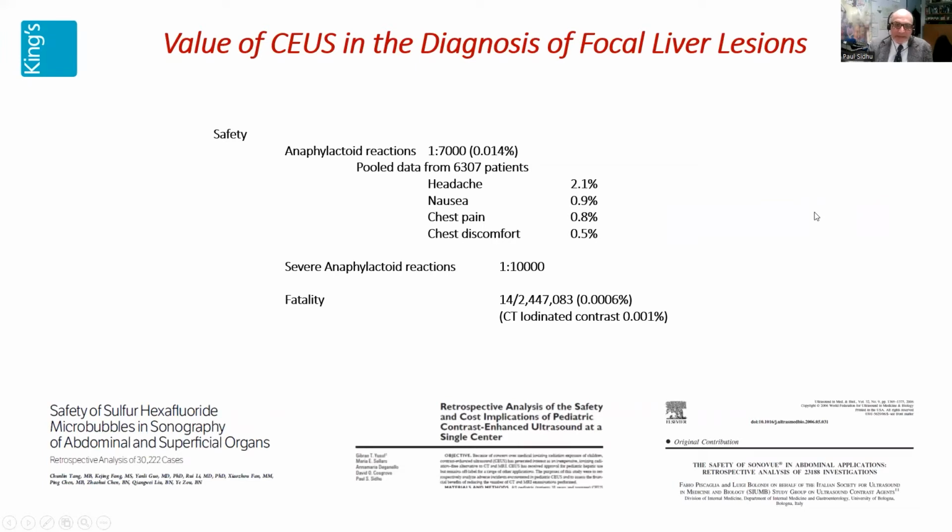The safety has been established in a number of publications, most notably the publication from Italy where 23,000 patients were examined and there were no adverse effects of note.